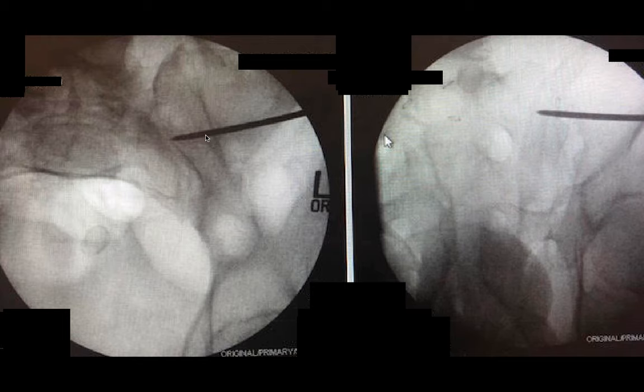So I tend to start my guide wire by tapping it gently in and then directing it the way that I want. If I extrapolate based on this line where that's going to be, it looks like you're ending up in the center of the body there. And then here you're obviously staying above the foramina. So generally I'm okay with that.